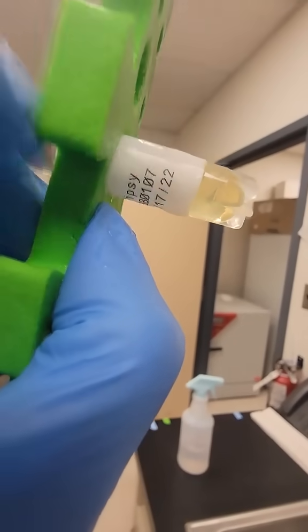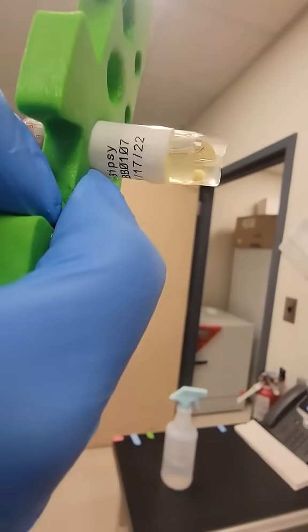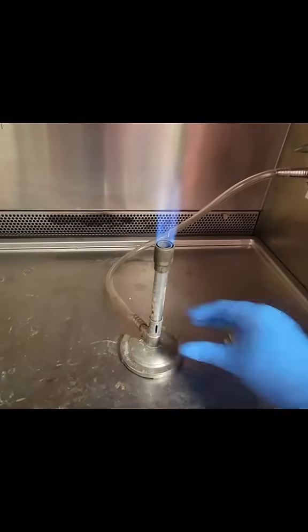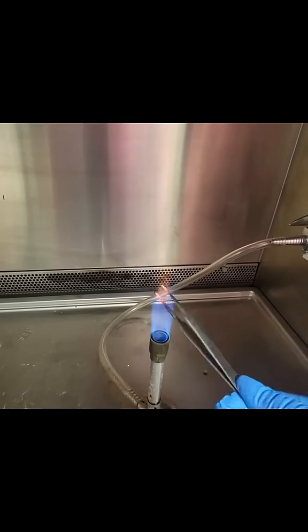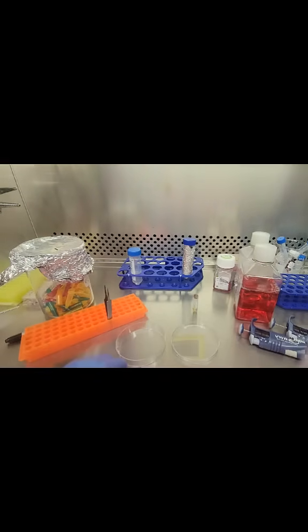This is what a skin biopsy looks like from a patient. Come with me to plate this out and get patient-derived skin fibroblasts. I first needed to sterilize the forceps I was going to be working with, so I put them under the Bunsen burner until they were red hot, sterilized them, and brought them into the cell culture hood.